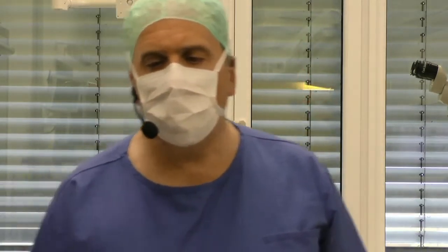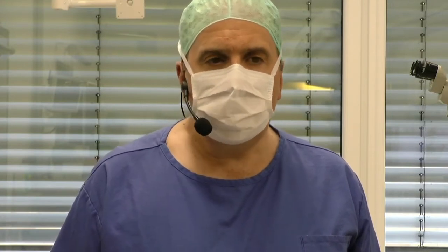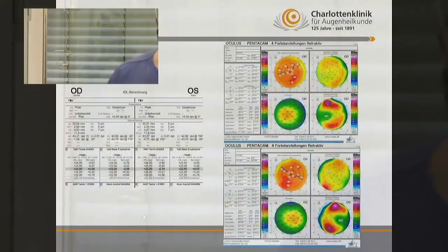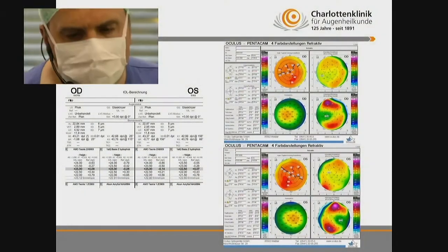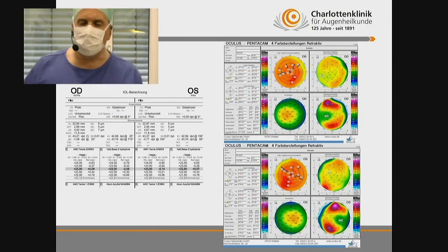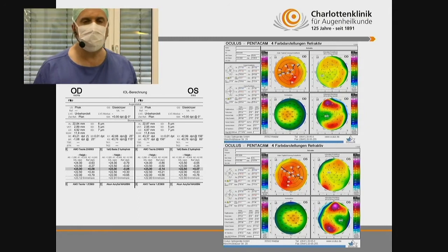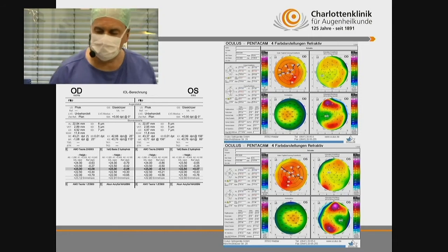So I would like to introduce you now to the second patient. We will also perform a bilateral refractive lens exchange with the Liberty system. The patient has plus 2.75 and plus 2.5. It's just on the border on the right eye, it's roundabout 0.75, and this is normally where my margin is to use a toric IOL in a multifocal patient or not. The left eye is lower, so I decided to use a monofocal IOL as a basis lens and the multifocal add-on on top of it.